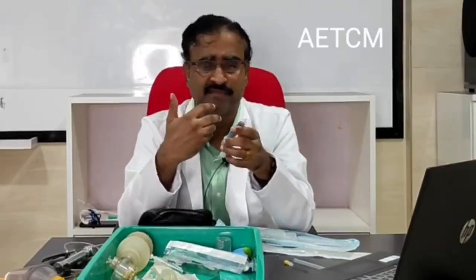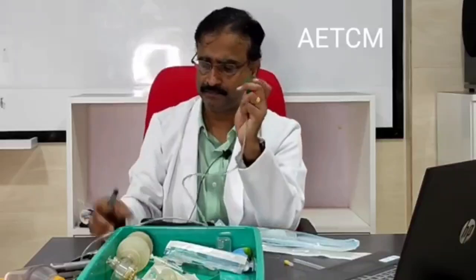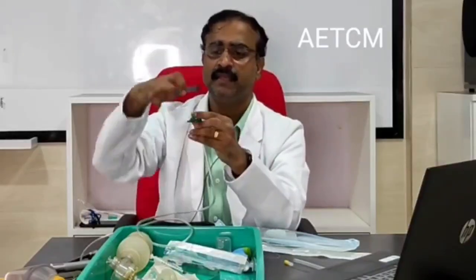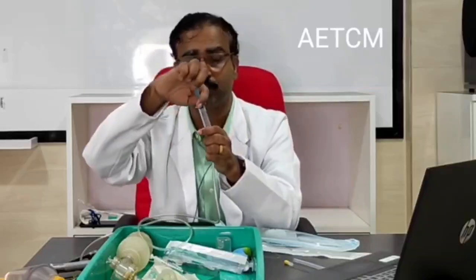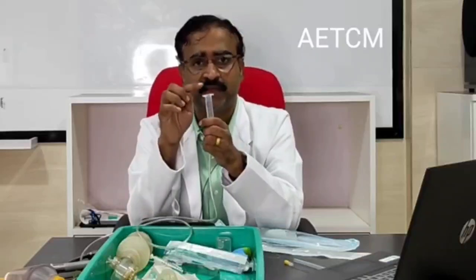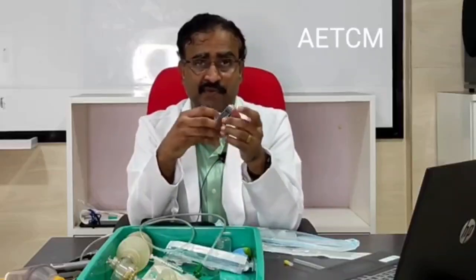This is used basically for therapeutic and for diagnostic purposes. Therapy, yes, you have to give lots of medications. In fact, even feeding, you attach this to an NG tube. Once it is attached to an NG tube in this way, feed is put inside this and then the feed is allowed to run in. So this is called a gavage feeding. You would not like to push in the feed, you would just fill the syringe with the feed, and then you can see it gravitate downwards towards the stomach. So that is the use of a syringe for therapy.